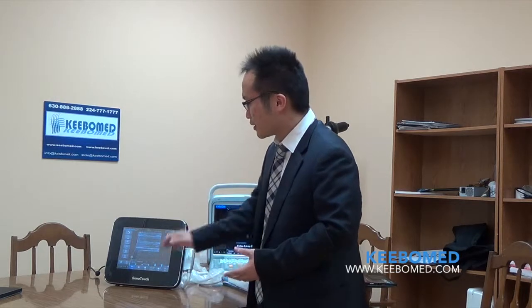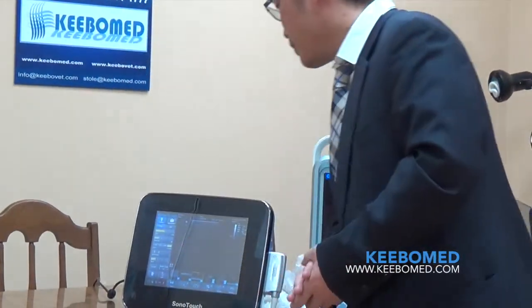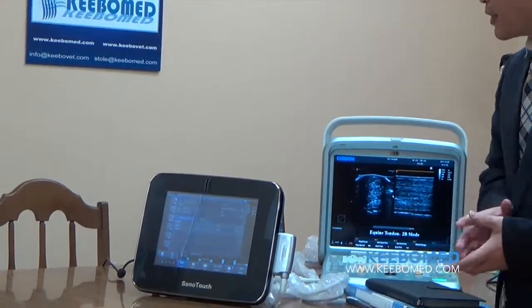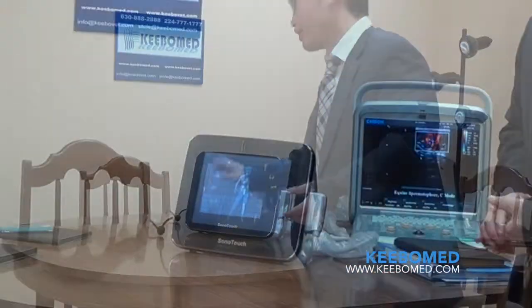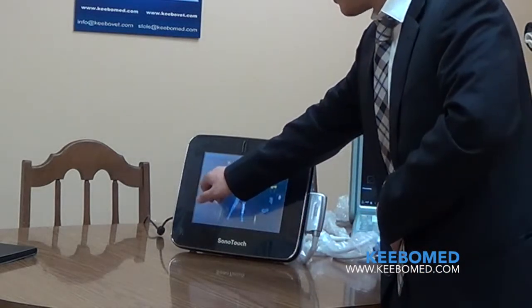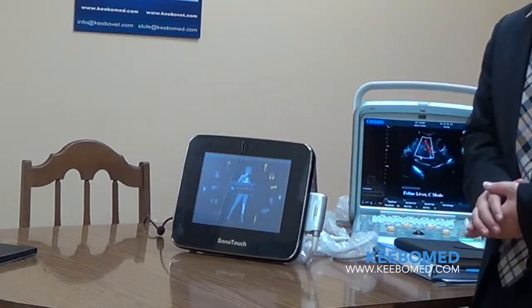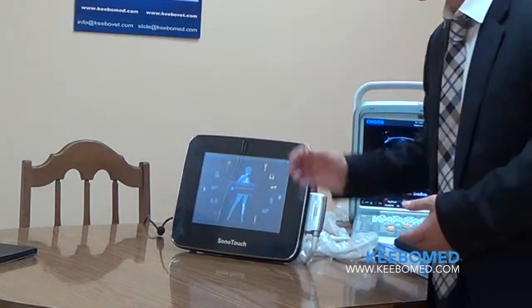The name of this model is SonoTouch — everything is just touch. It's very intuitive. When you press 'Patient', you can input all the patient information into the interface. Our system is very smart. When you press a button, it will tell you which probe you want to connect — it can recognize the probe automatically.